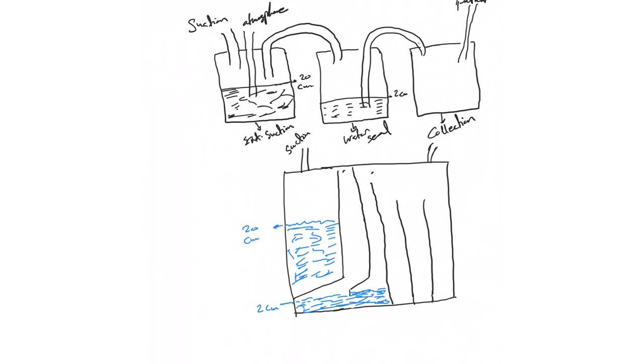Now we explain the three-chamber system. The collection chamber is here — this is the patient, the tube, the chest tube connected to the collection department that collects air or blood. The air will go to the water seal chamber, which has two centimeters. Then there is the external suction chamber connected to the water seal chamber with 20 centimeters of water as a safety mechanism, guaranteeing no more than 20 centimeters of negative suction applied.